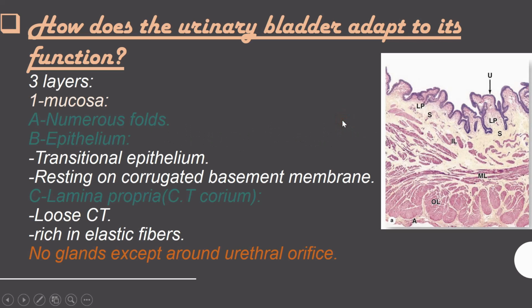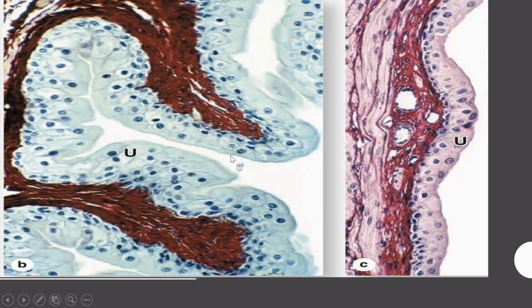The innermost layer of the urinary bladder is the mucosal layer, which is lined also by transitional epithelium, the urothelium, which is indicated by the arrow. When the bladder is relaxed, the epithelium layer appears to be made up of rounded to cuboidal cells. If the bladder becomes distended, then the urothelium can be stretched out and ends up consisting of stratified squamous cells.